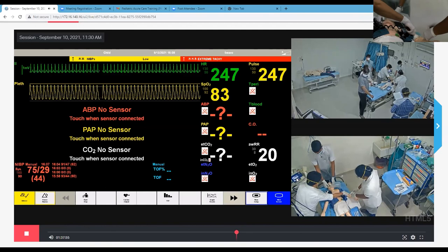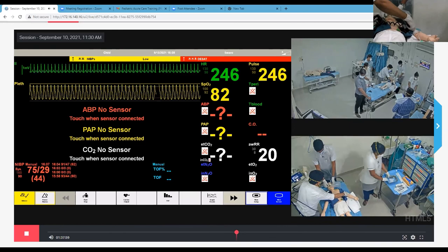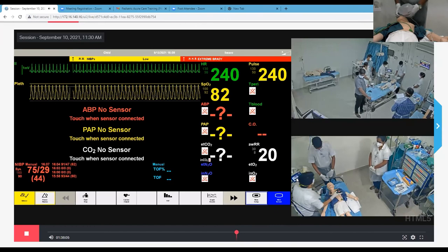I'm ready with this. So I'm going to deliver the shock. I'm clear, all clear. Disconnect oxygen. Shock delivered.